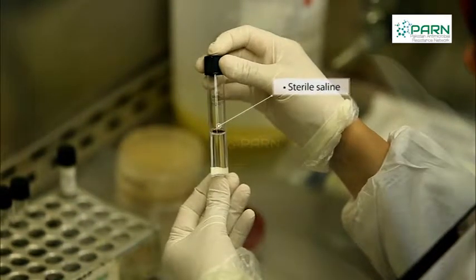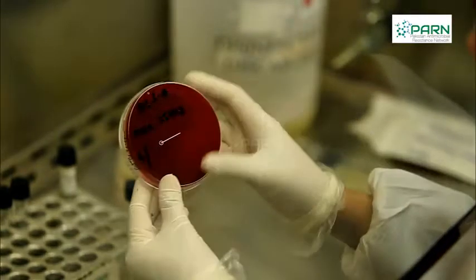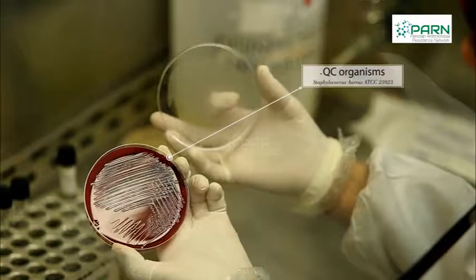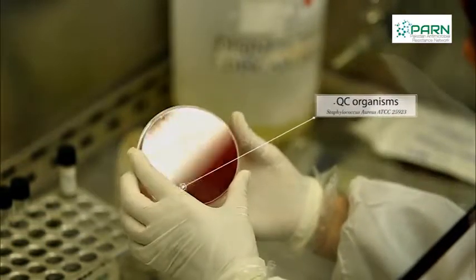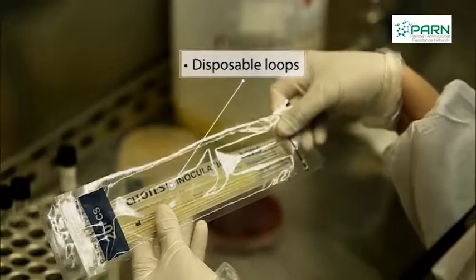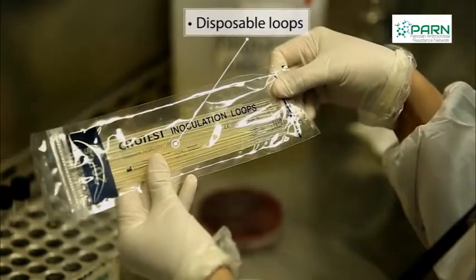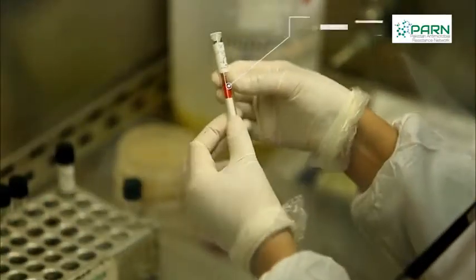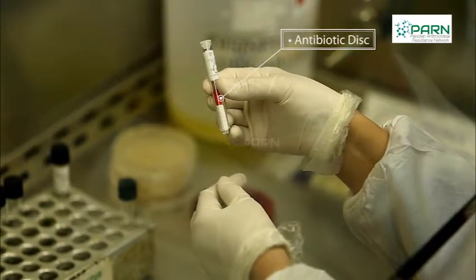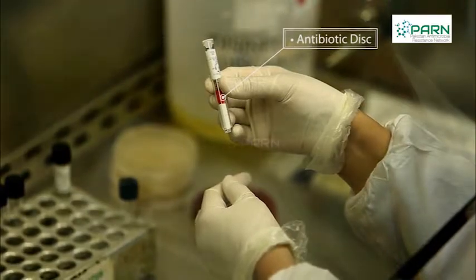Quality control organisms include Staphylococcus aureus ATCC 25923. Other requirements include disposable loops or wire loops and antibiotic discs. The antibiotics are selected on the basis of organisms and source of isolate, for example blood, urine, etc.